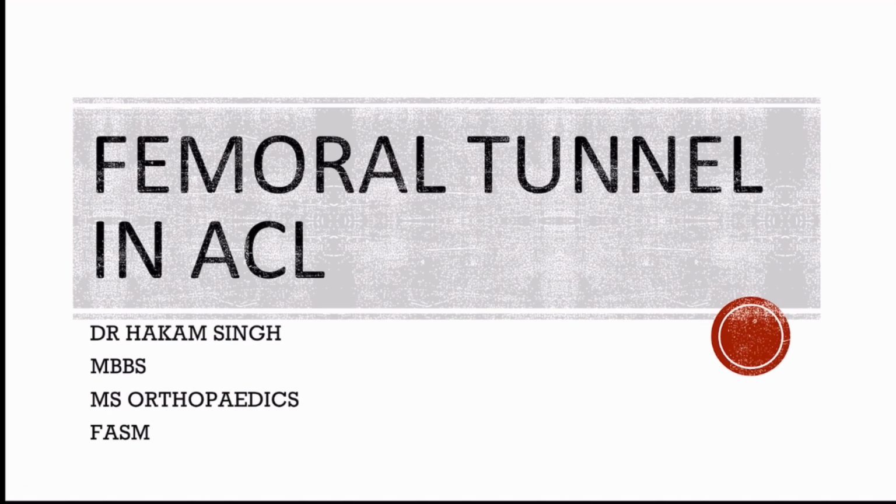So today I am going to make one video on femoral tunnel ACL, as it is the most difficult part in ACL surgery because a lot of calculations are involved, like how much to drill, how much is the tunnel, what endo button size to use. So I will discuss that all in detail here.